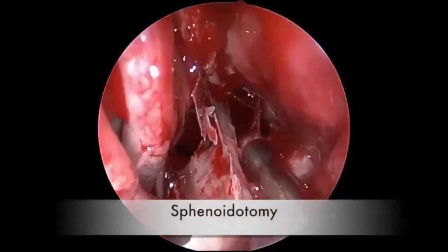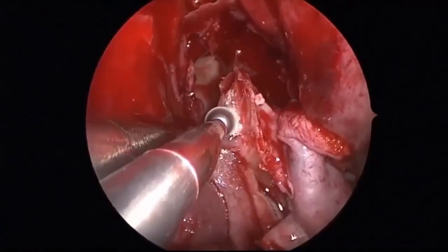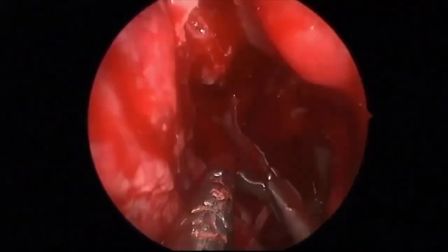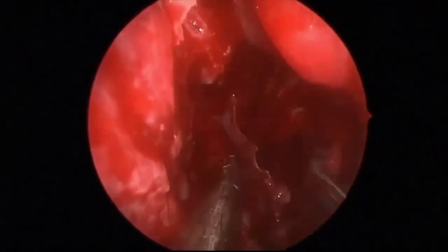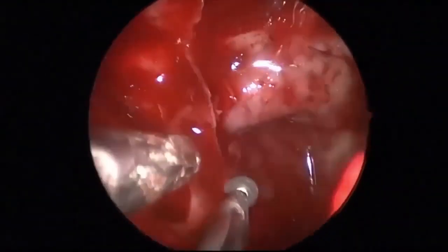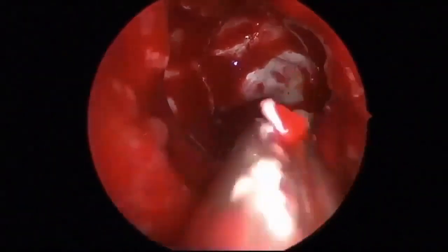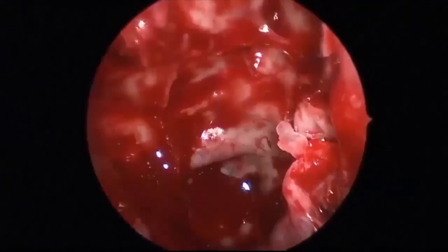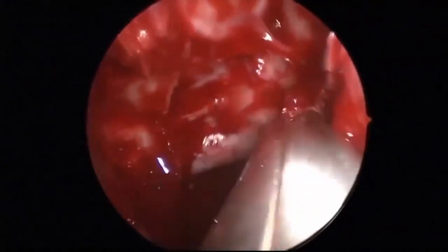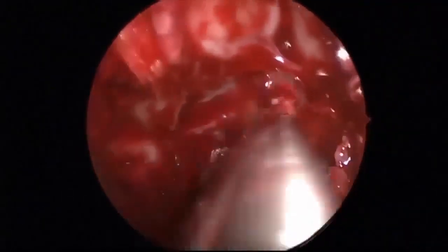The ostia of the sphenoid sinus are enlarged on both sides, and sphenoidotomy is performed. This can be done with a Kerrison or with a drill. At this stage, using a cutting burr is reasonable, although once we're removing septations, we tend to switch to a diamond burr. Here we're using the diamond burr to drill down all the septations of the sphenoid sinus, which we have to remove flat. The anterior wall of the sphenoid is opened quite extensively on either side, laterally, in order to provide enough room for us to place 2 instruments as well as an endoscope within the sphenoid sinus itself.